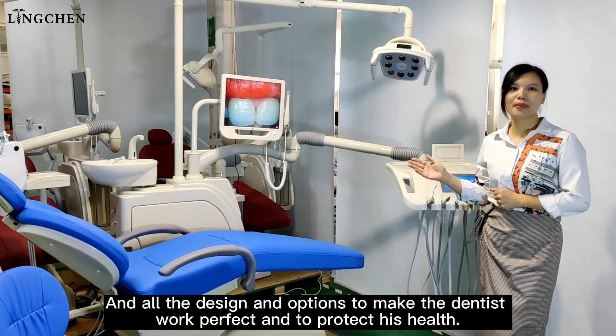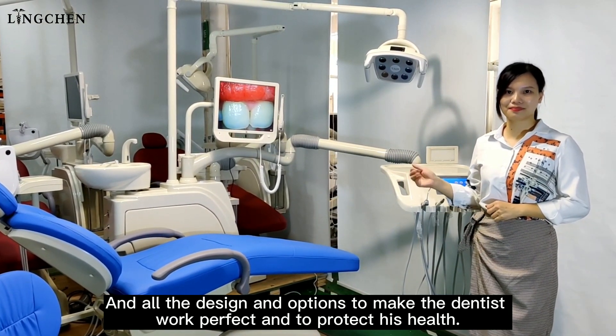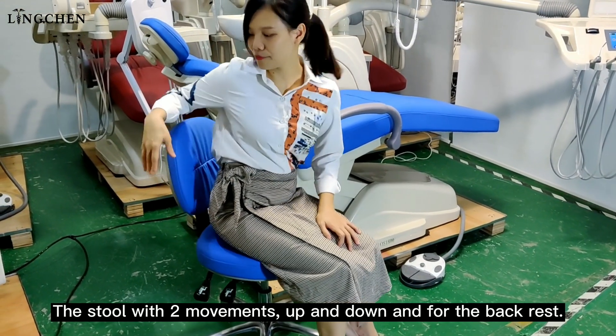We start from the stool. The stool has two movements — up and down — and also movement for the backrest.